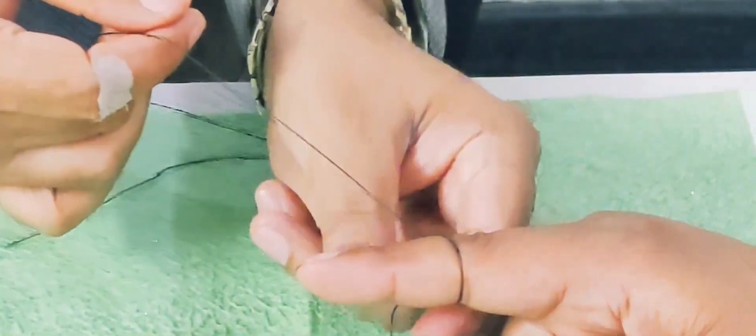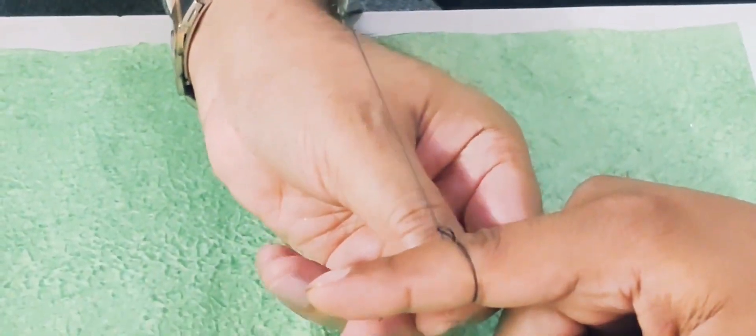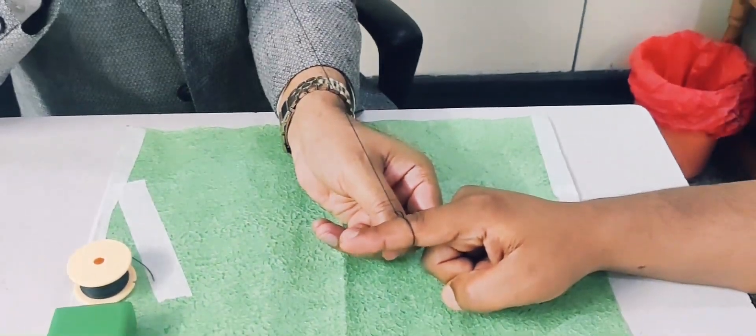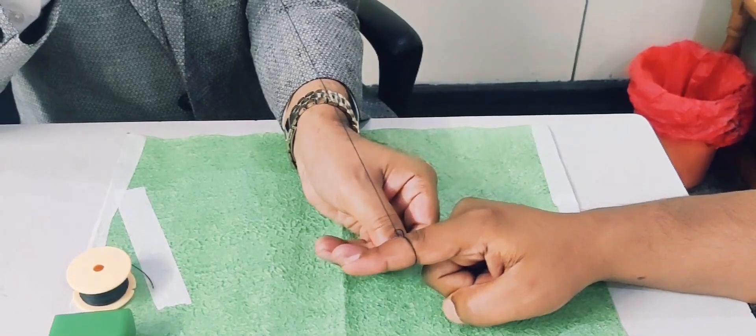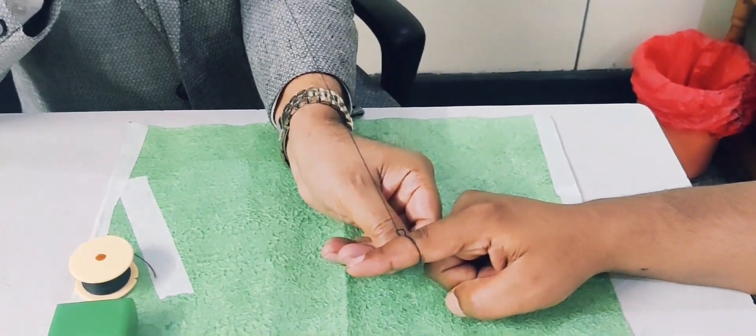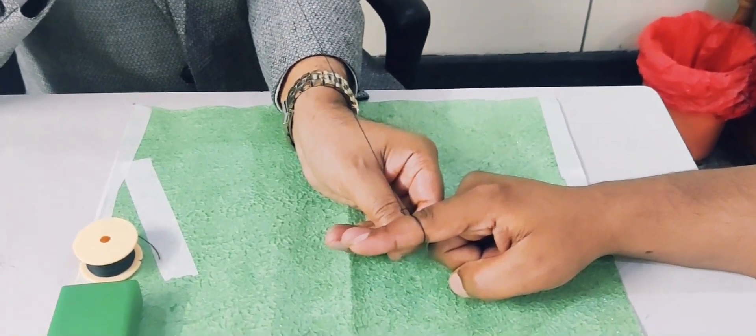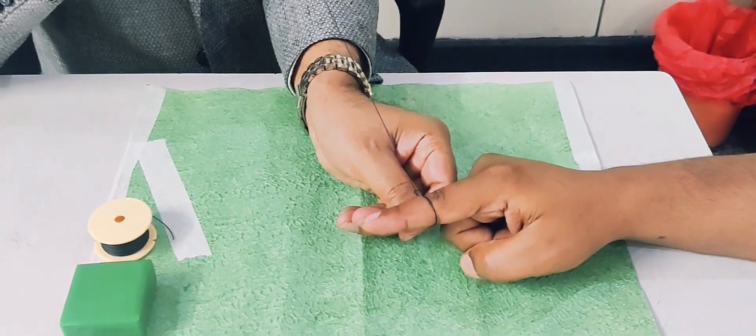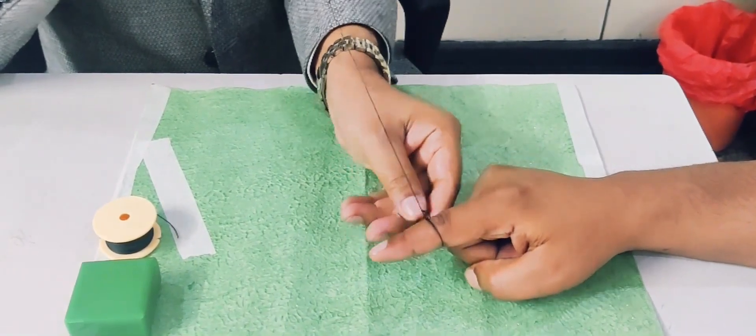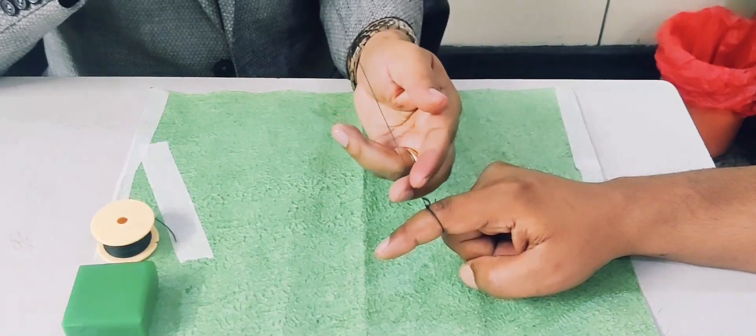And you will hold this with the Maryland, and you will do the longer arm. This is going to be outside. That's why it is called extracorporeal knot. And you can tie the knot, you can give the pressure, appropriate pressure, and your knot is ready. And then you cut your thread from here, and then you are out.